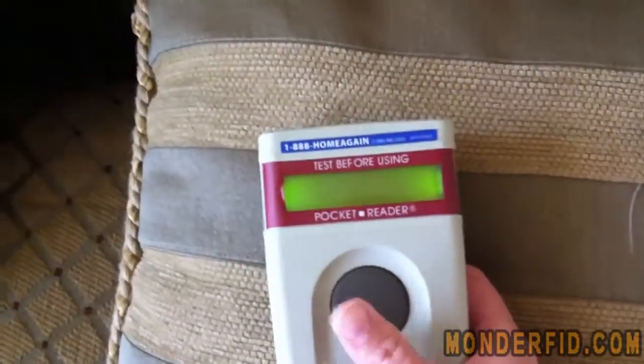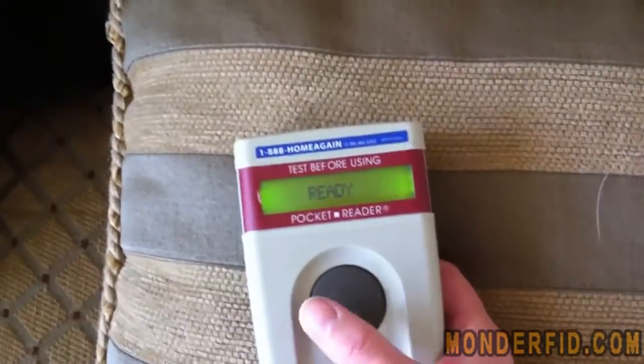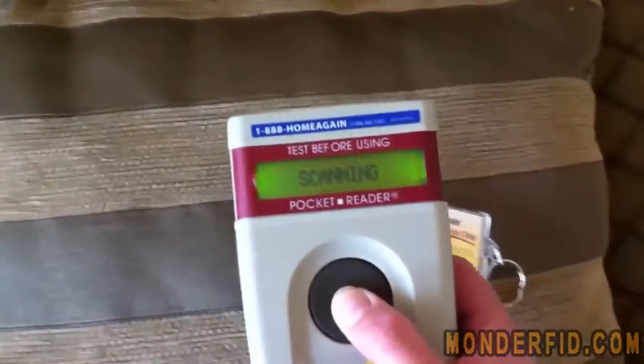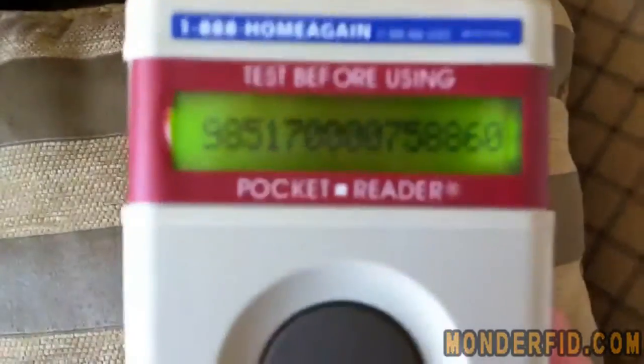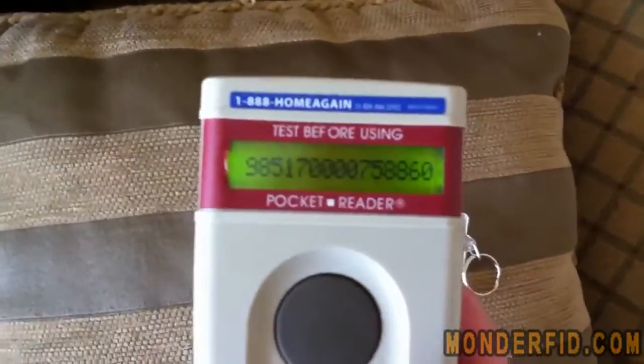You hold it down to turn it on. It gives you its scanner number and then says it's ready. You hold down the button and it starts scanning. You move over a chip and it gives you a number. Once it gives you a number you can let go of the button — it will hold that number for like 10 seconds.